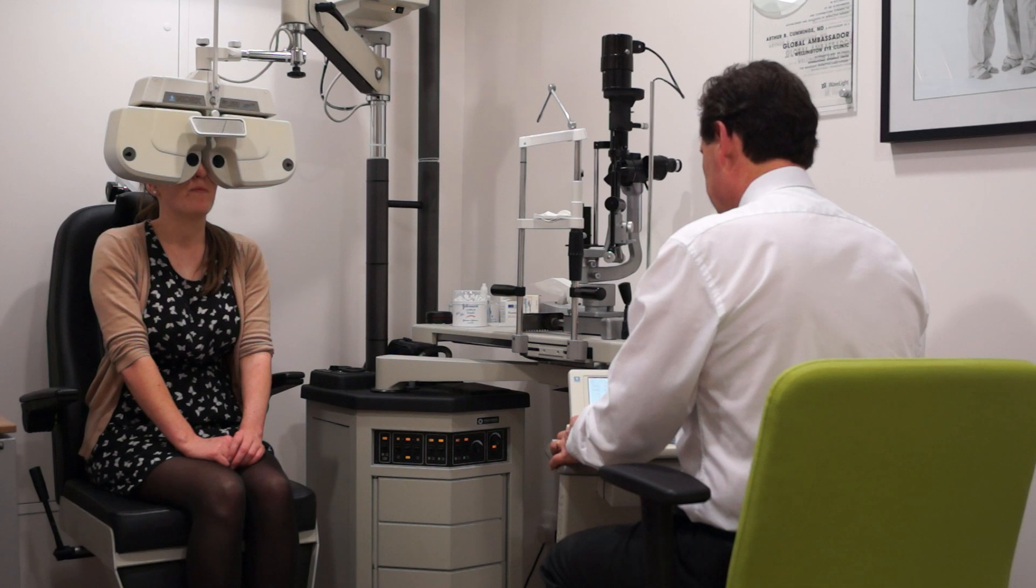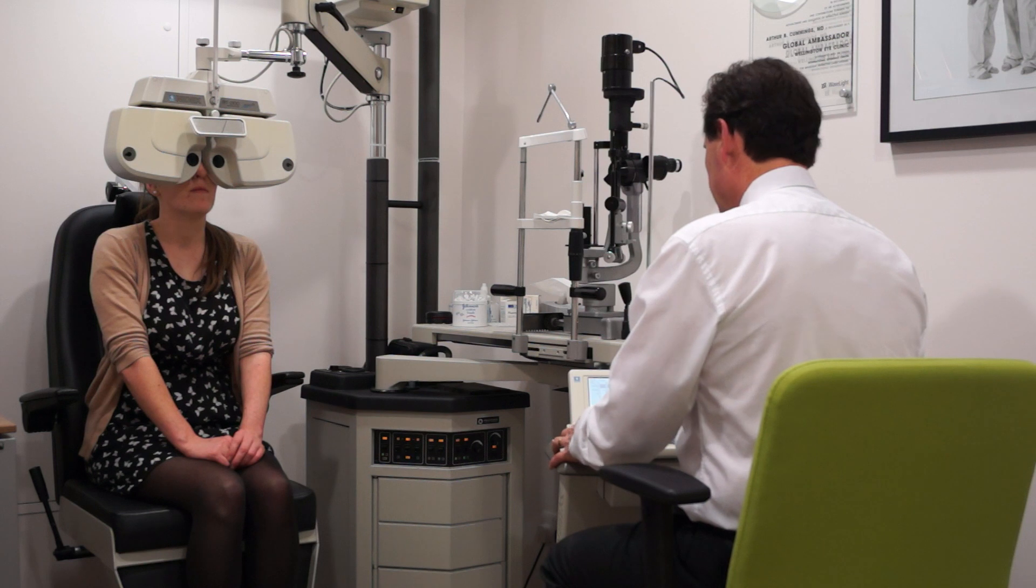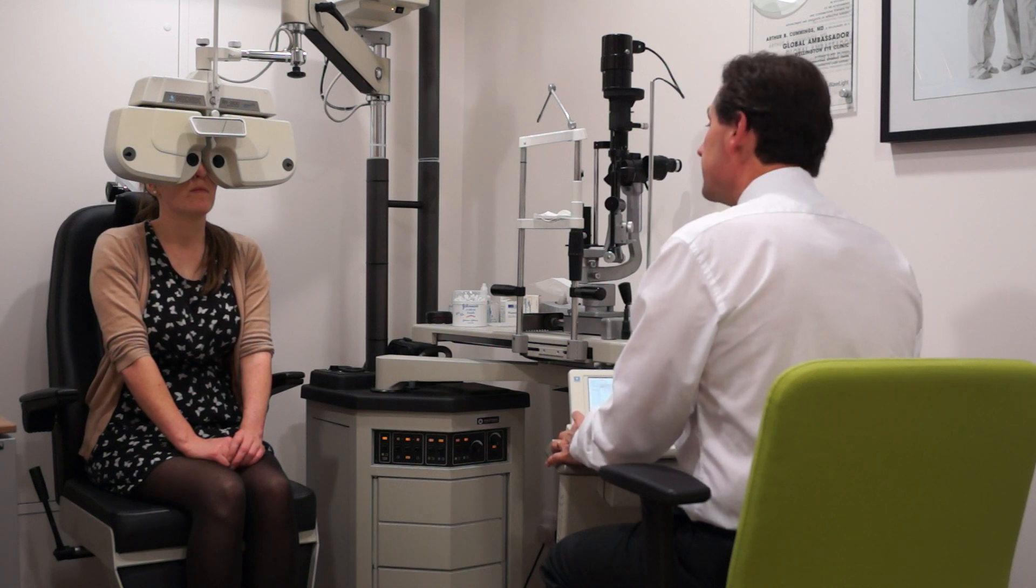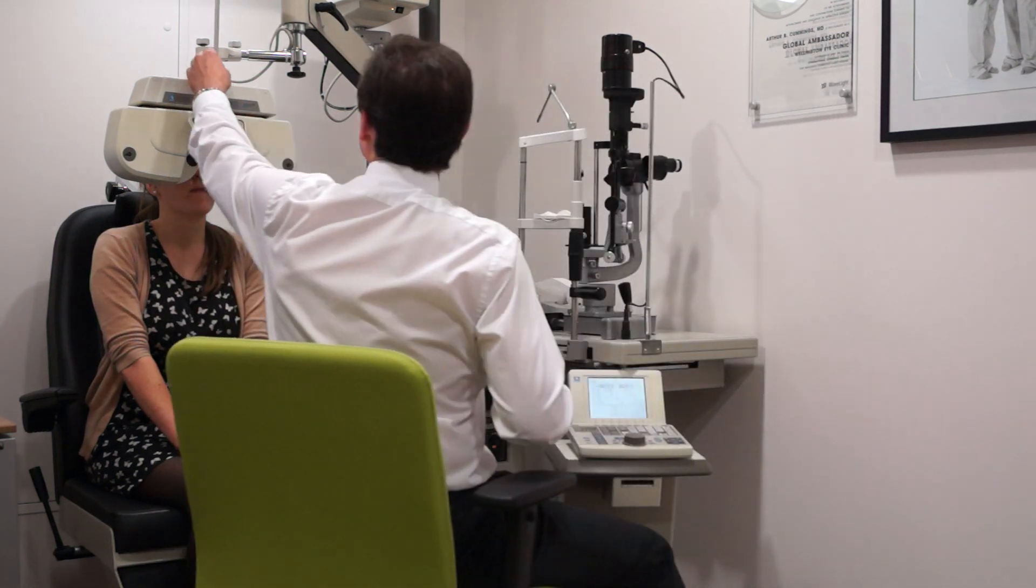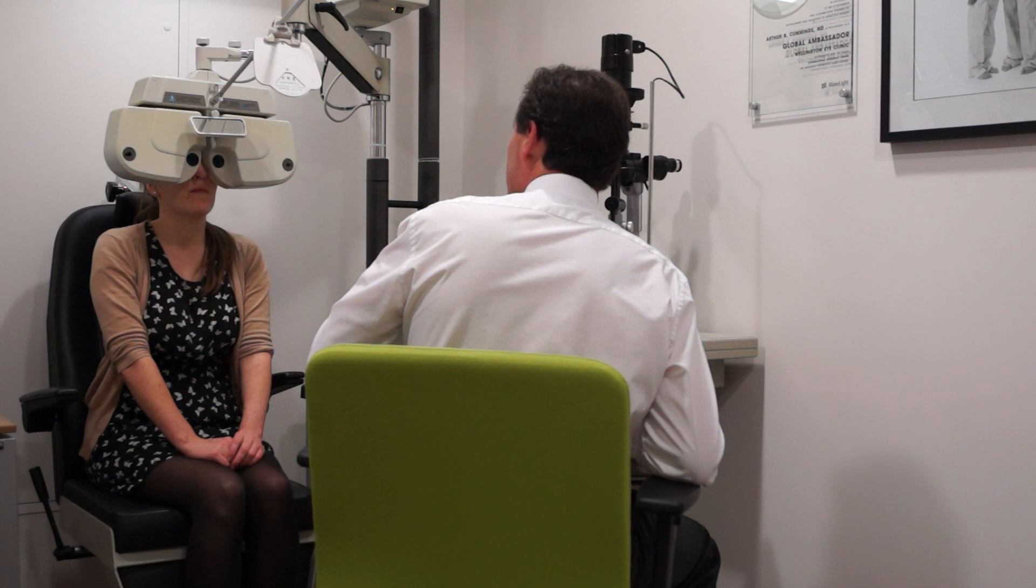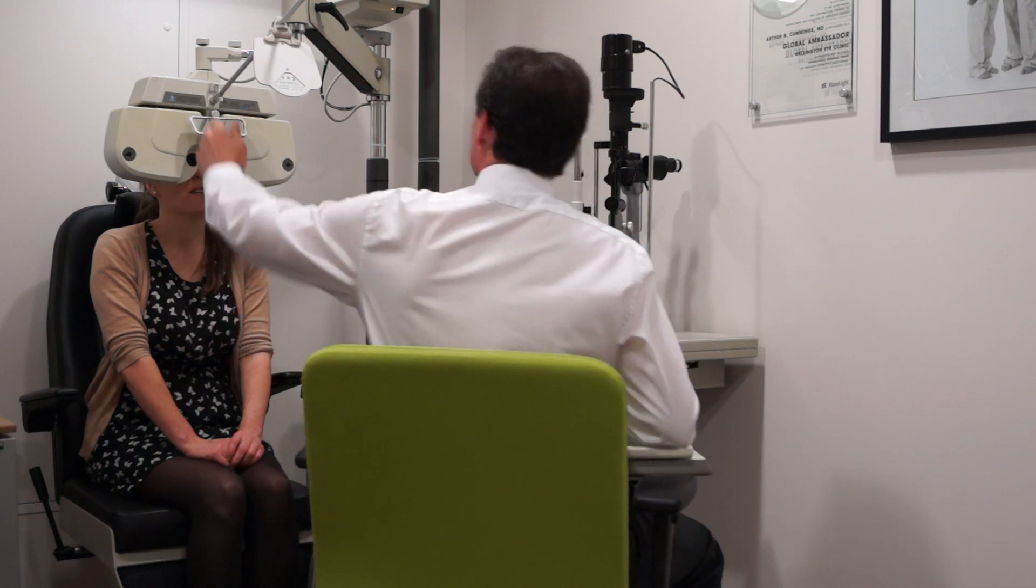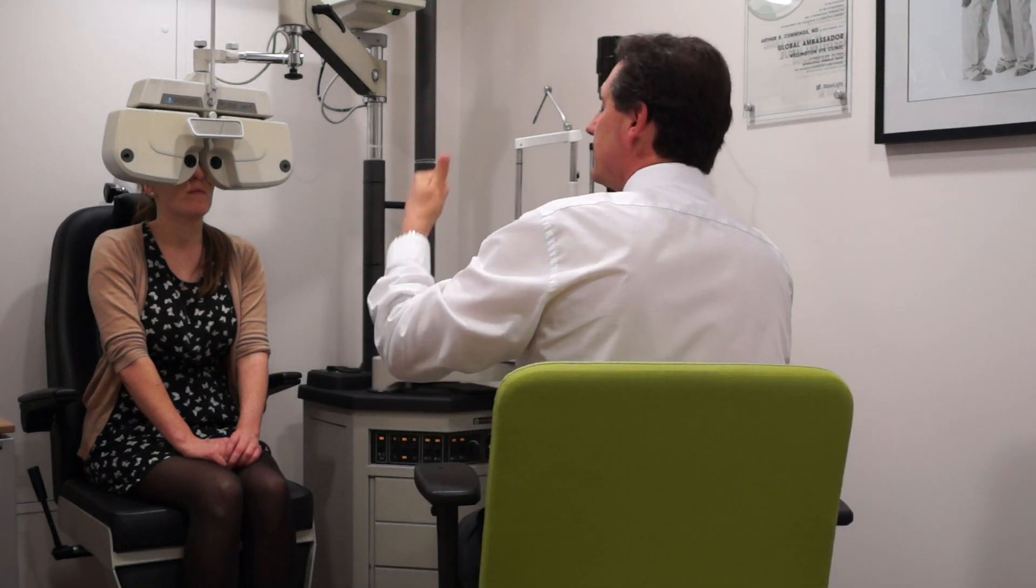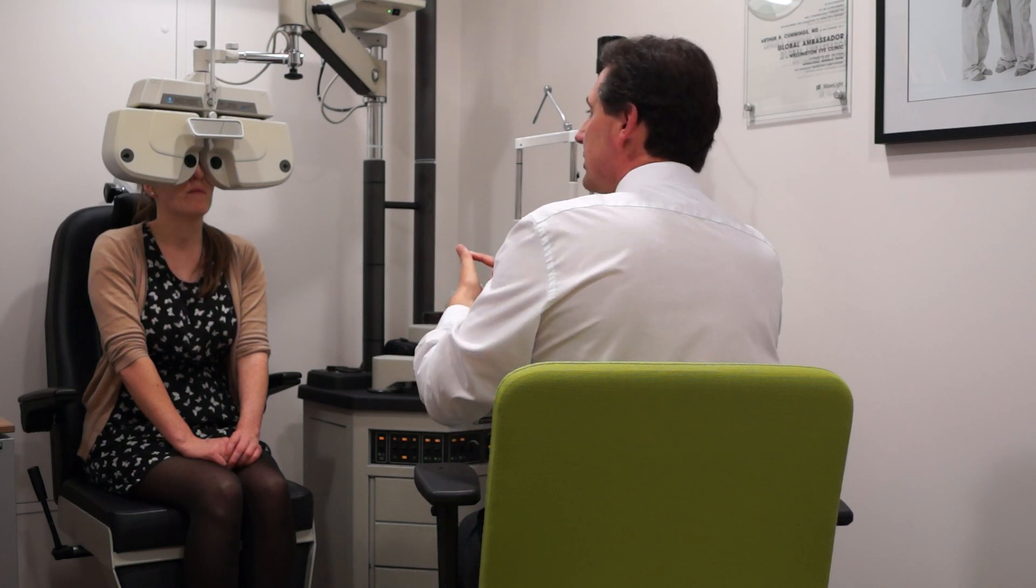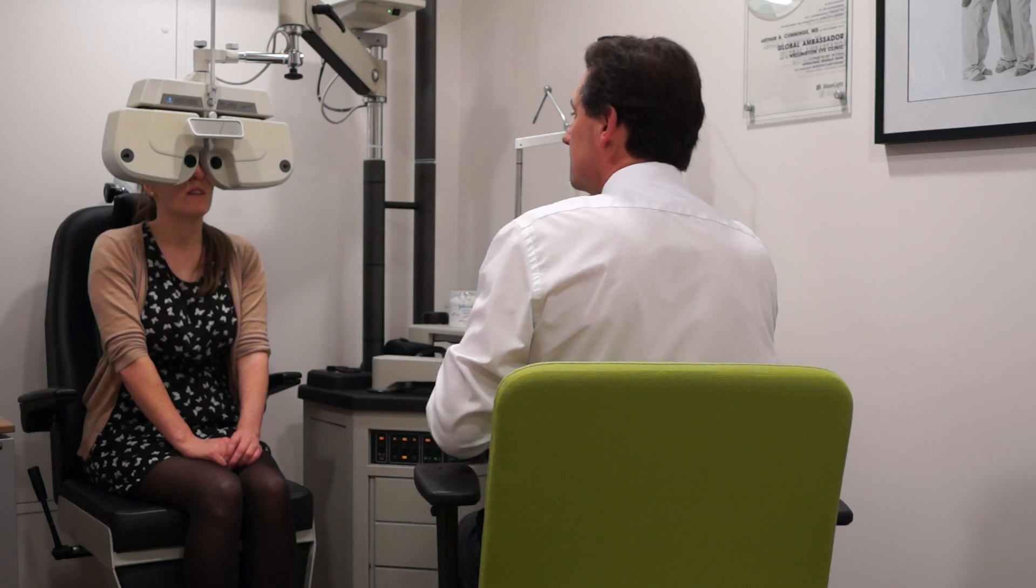This is what you have with both eyes perfect. But with both eyes perfect, you can't read up close. When you do monovision, the distance reduces a bit, but now you can read. So this is your distance vision at the moment with both eyes perfect. And that's quite tricky. And with monovision, that looks a little better. So what you're really weighing up is how much did the monovision make my distance worse in return for how much did the monovision make my near better. And if you find the distance reduces only slightly, but the near improves a whole lot, then you've got a good solution.